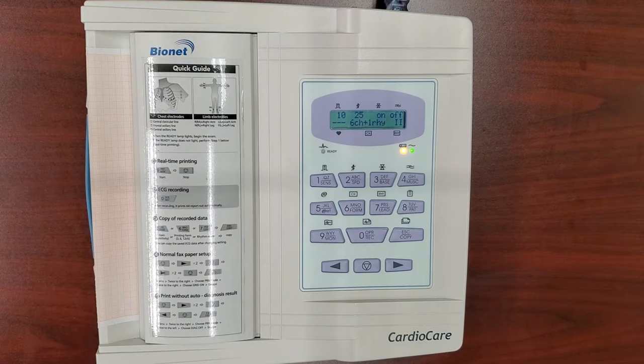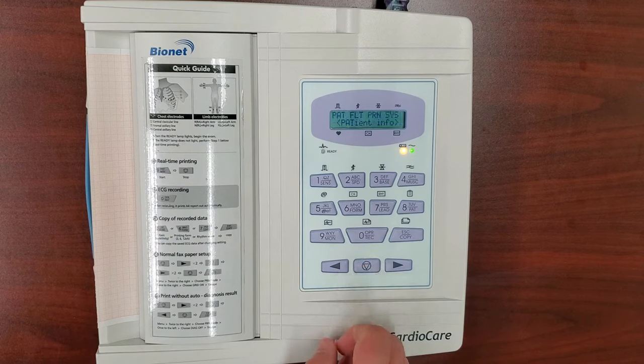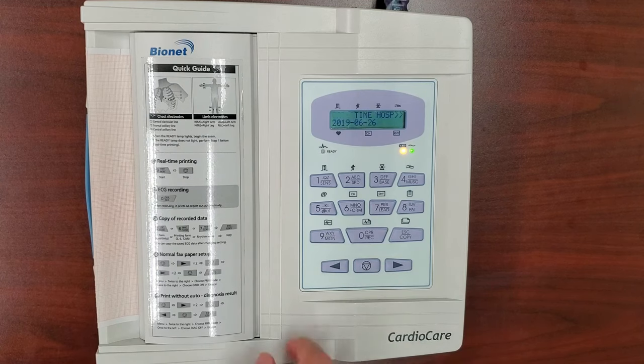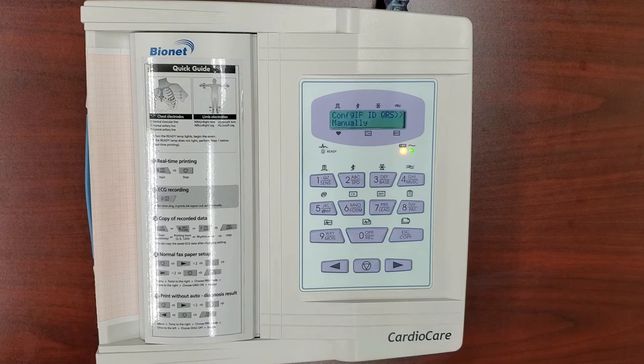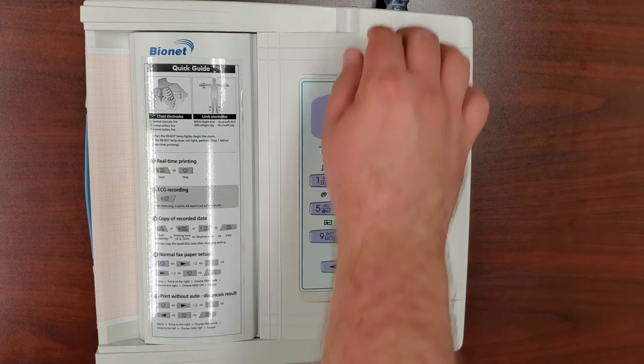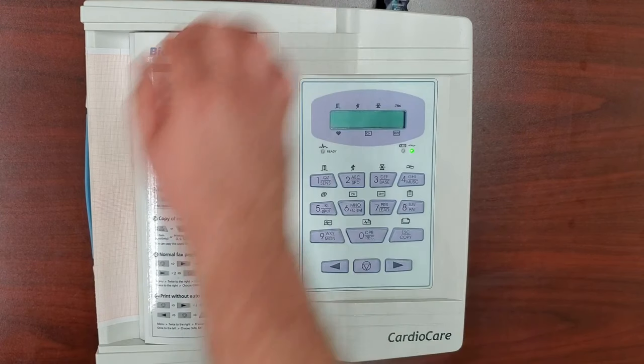You must first establish the connection parameters on your CardioCare 2000. Press the Menu button to bring up the menu. Press the right arrow key until Sys is highlighted, and press the Menu button. Press the left arrow key until you highlight Config IP. Press the Menu button to set it for DHCP. Now, power cycle the unit by turning it off and on to save network data.